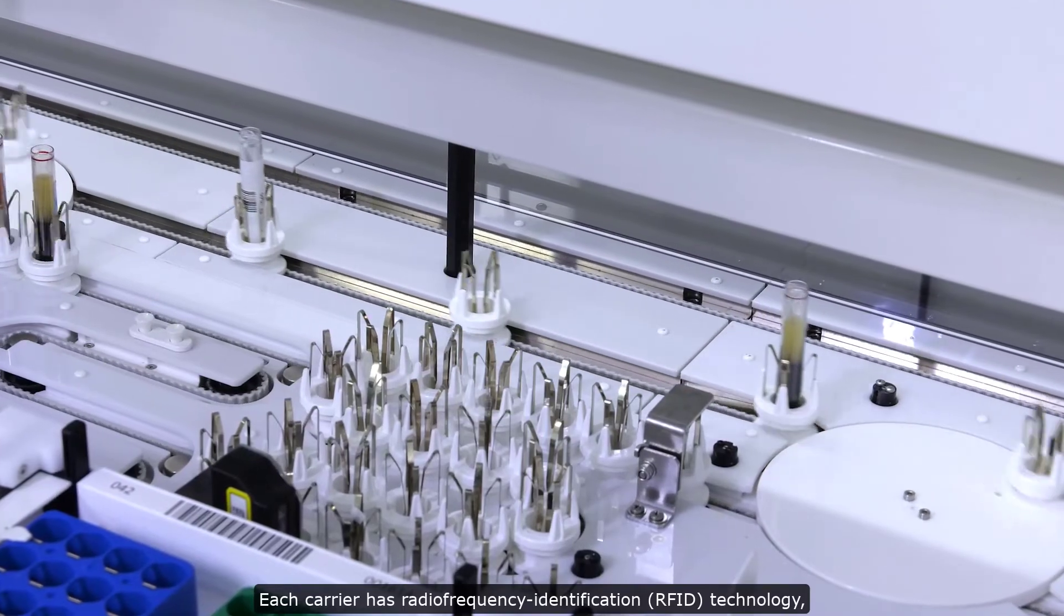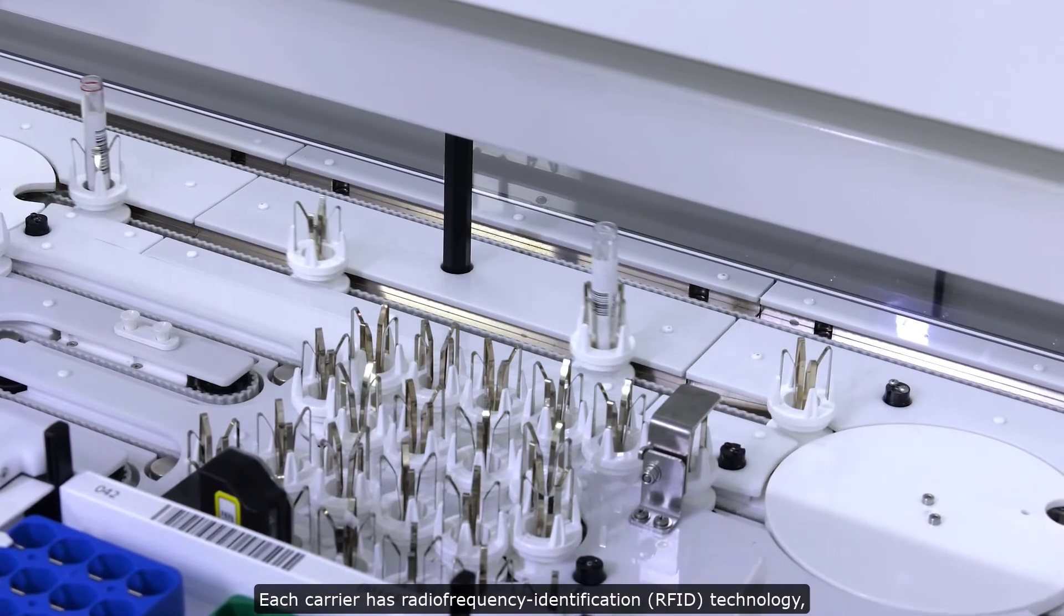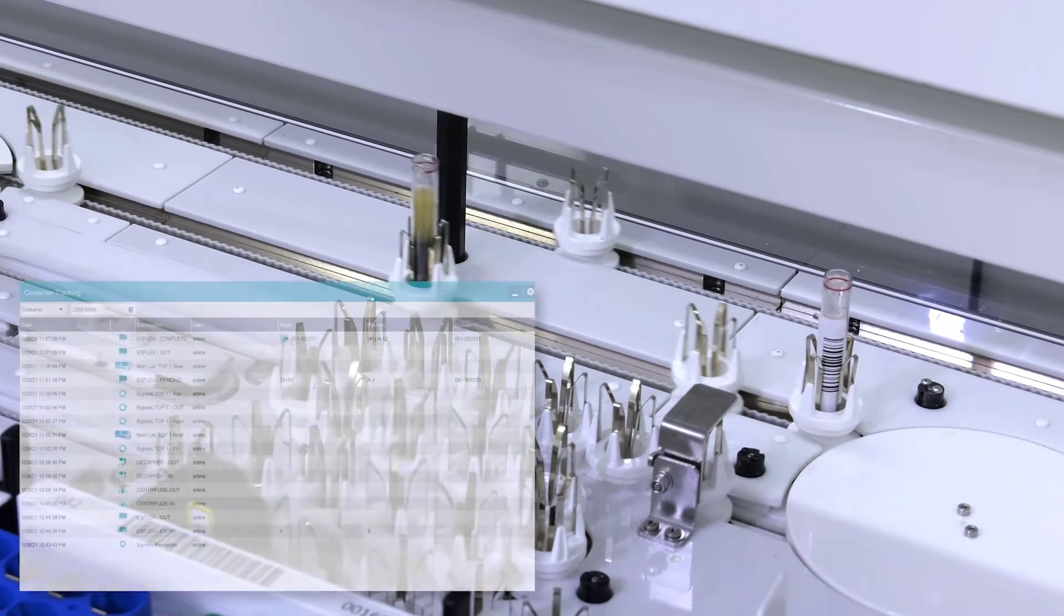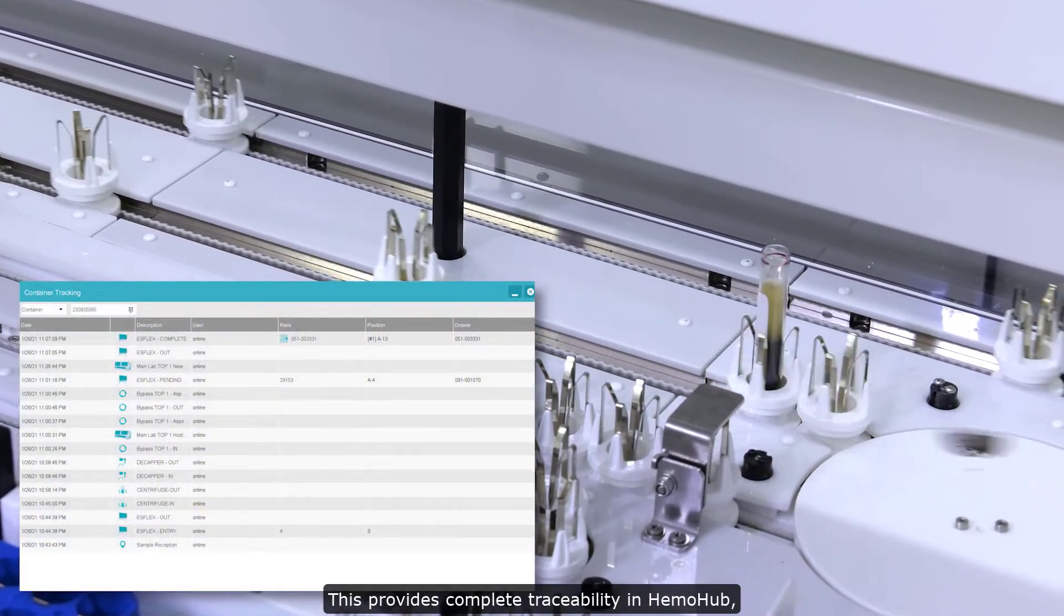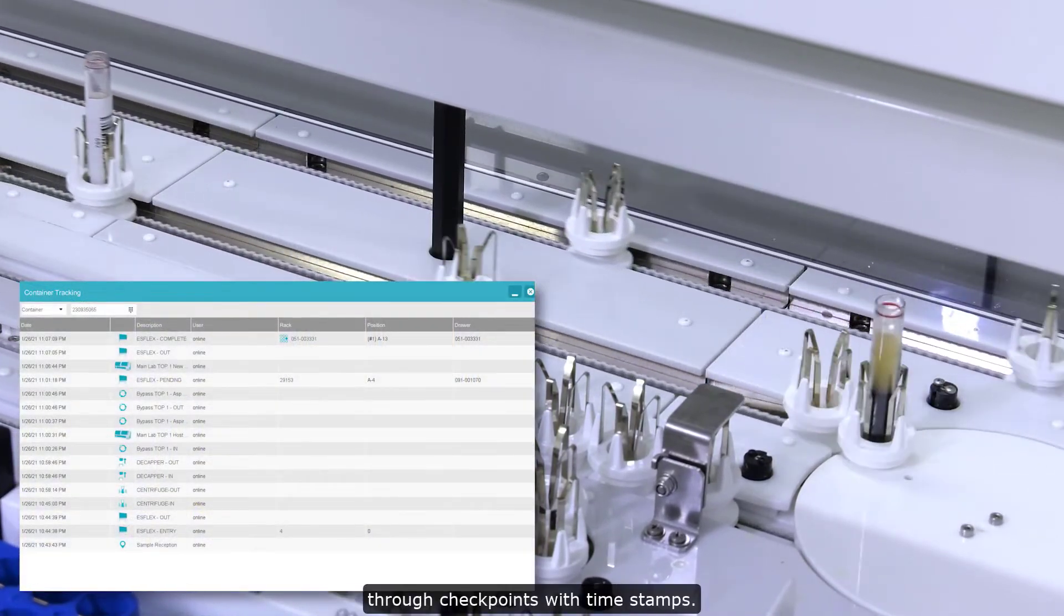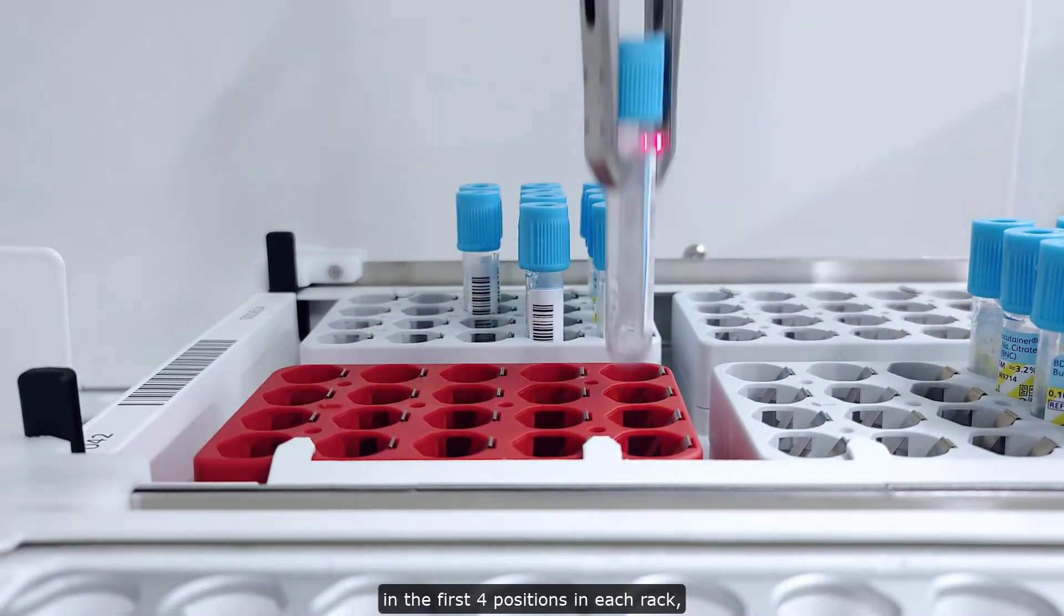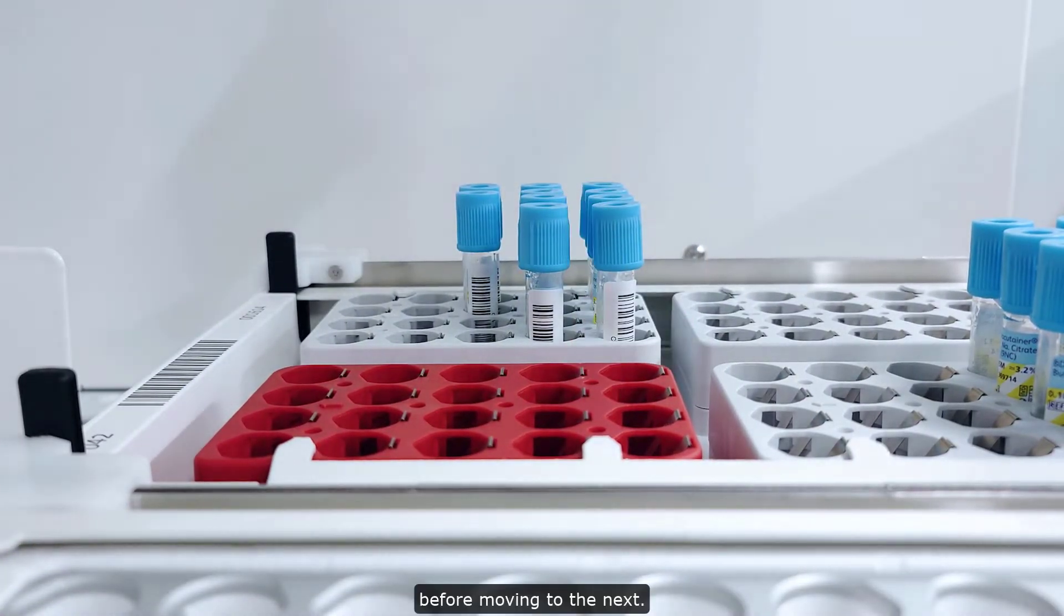Each carrier has radio frequency identification or RFID technology, optimizing sample flow and decreasing turnaround times. This provides complete traceability in HemoHub through checkpoints with timestamps. The system checks for samples in the first four positions in each rack before moving to the next.